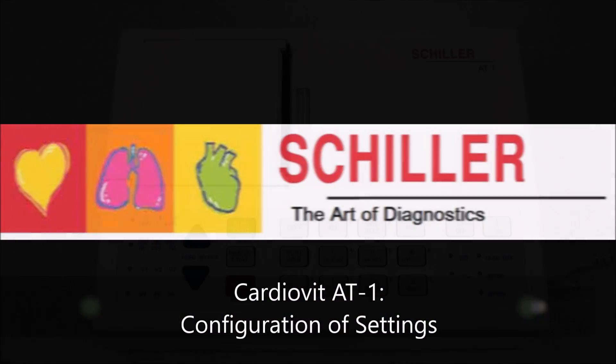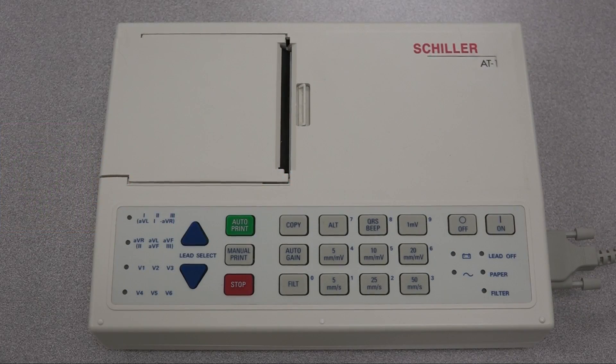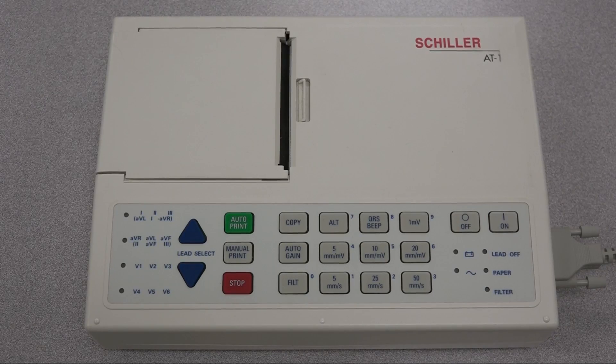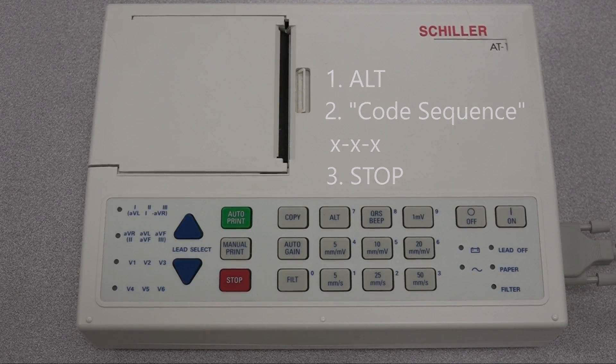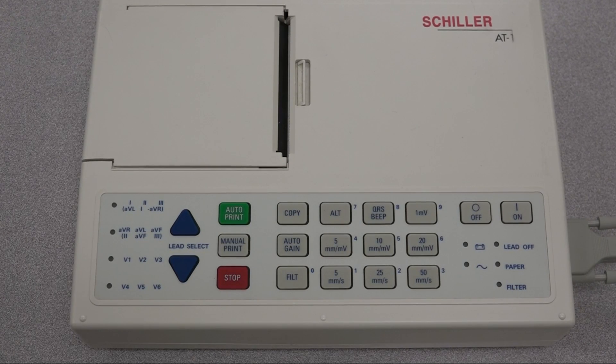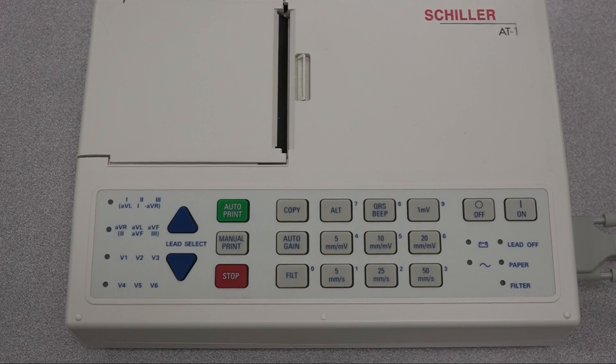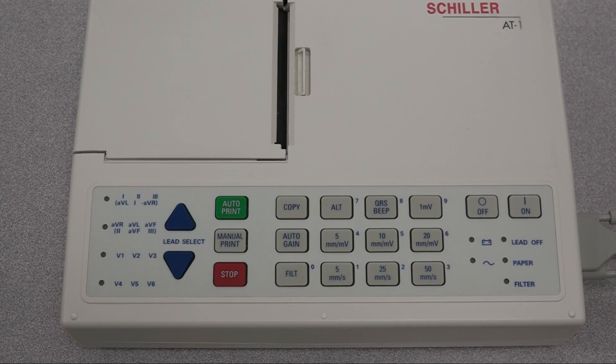Settings for AT1. Each parameter is set by means of codes which comprise a combination of keys starting with the ALT key. The setting is confirmed with a stop key. As soon as the ALT key is pressed, the keyboard is dedicated to the programming function. In the following slides, you can find the codes to configure each setting.